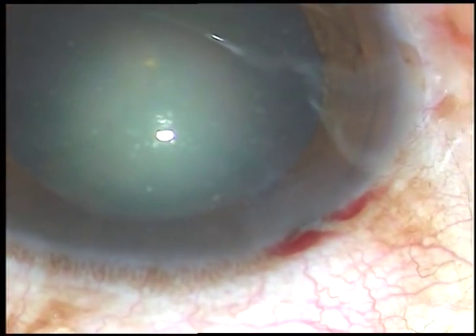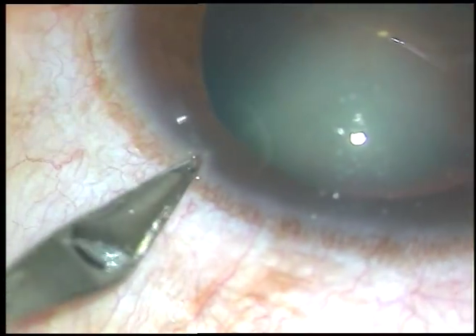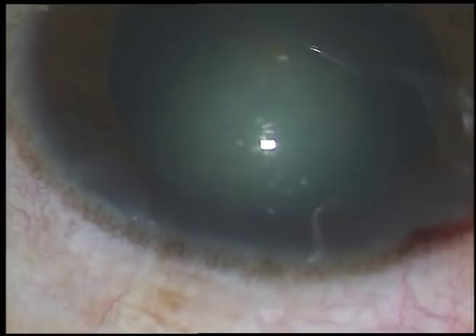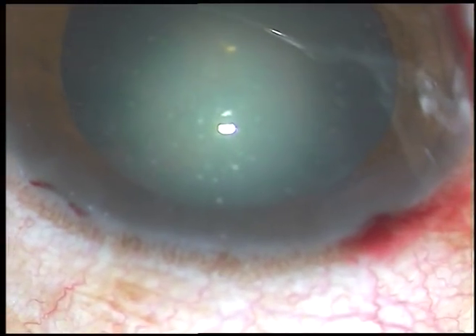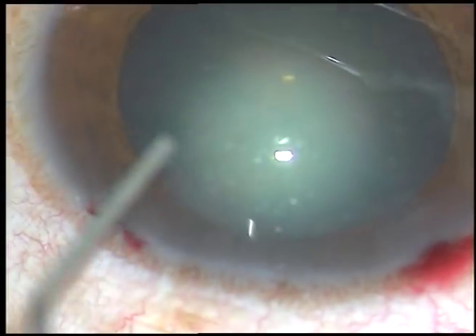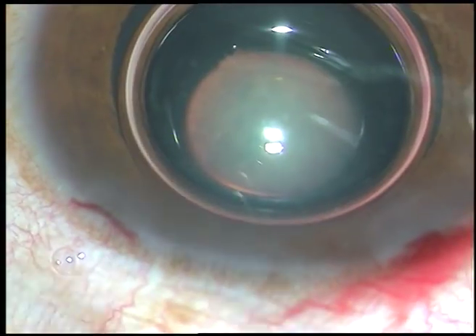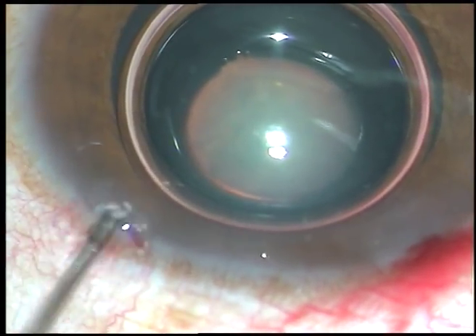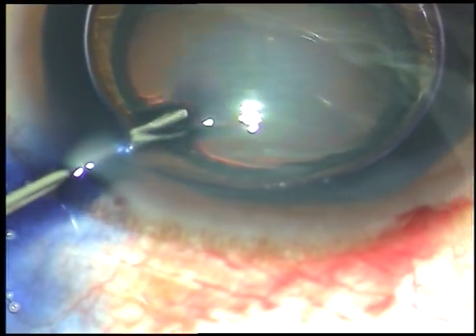This is the main incision — a 2.8 millimeter incision. In this case we are going to do only one side port. This is the side port, three clock hours away from the main incision. If the side port is three clock hours — that is 90 degrees away from the main incision — the astigmatism induced by the main incision is reduced to some extent by the side port.